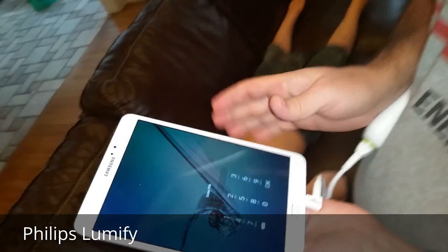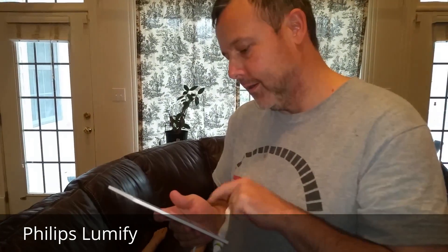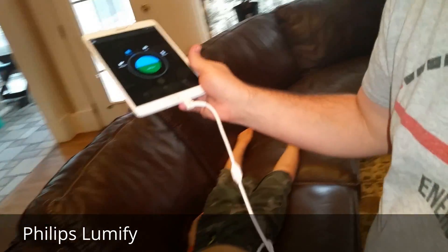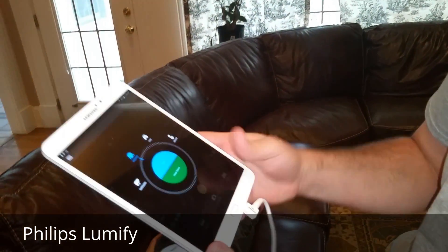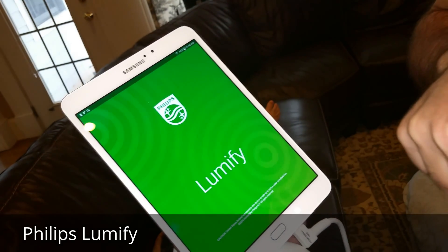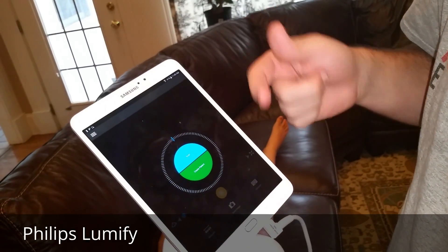You turn on your device and put in your PIN number. Then you download the Philips Lumify app — the Lumify boots itself up and you're ready to start going.